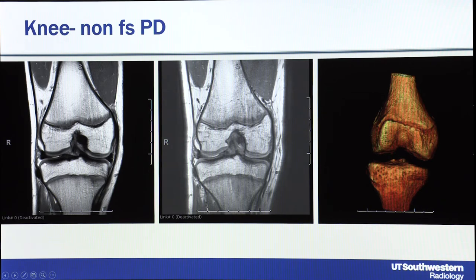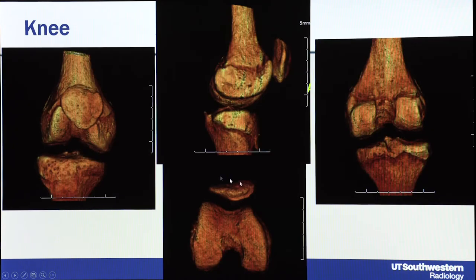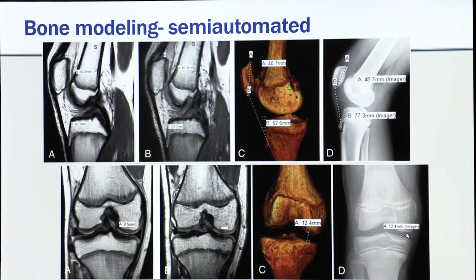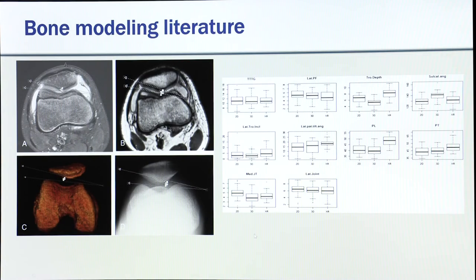You can use drive equilibrium to make the fluid white, which gives good differentiation of bone, cartilage, and fluid. These volume-based images can also be used to reconstruct bone from MR scans — not from CT — and you can add the patella and view it in different planes, performing measurements similar to CT scans and plain films. Some of our literature on this is available online.